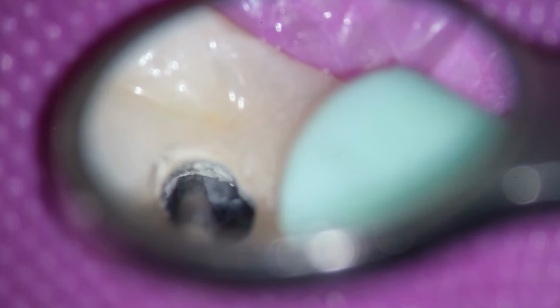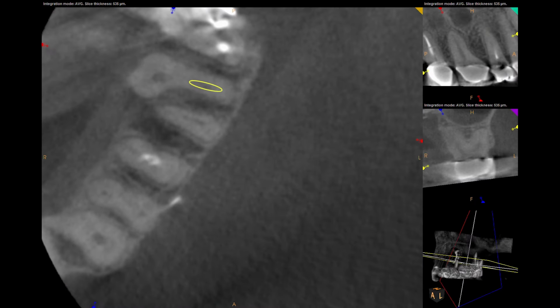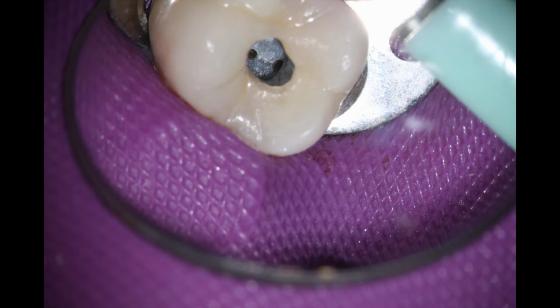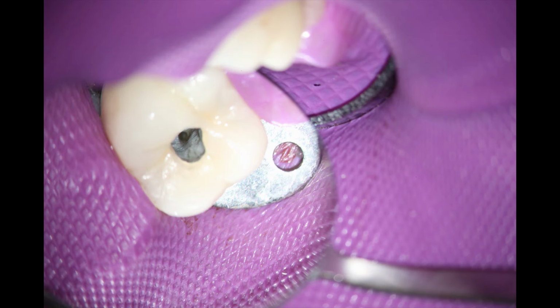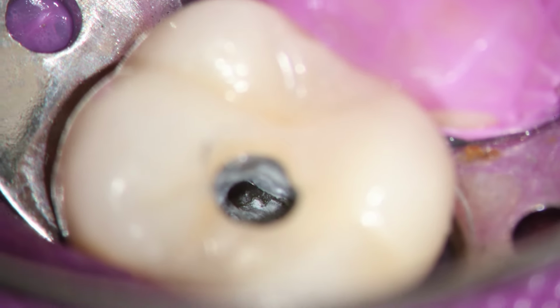And as you can see here, I'm trying to find the distal buccal and the palatal canal. Looks like they were joined, and then I use the ultrasonic tip to very accurately enter those canals. And it's all done without the assistant having to be chained to my mirror. So after the initial instrumentation, you can see we found all of the canals without hollowing out the root and without having the assistant sitting there constantly keeping my mirror dry or clean.